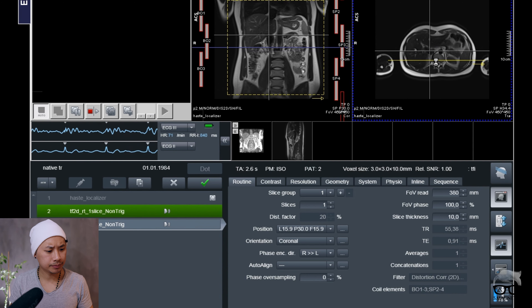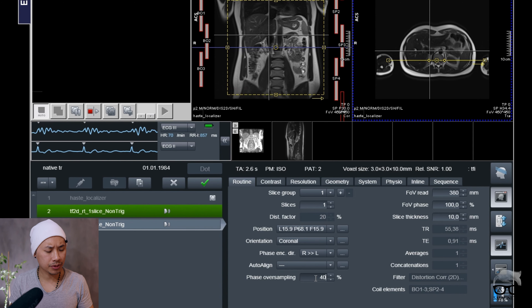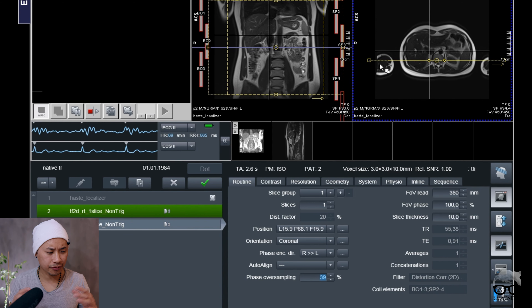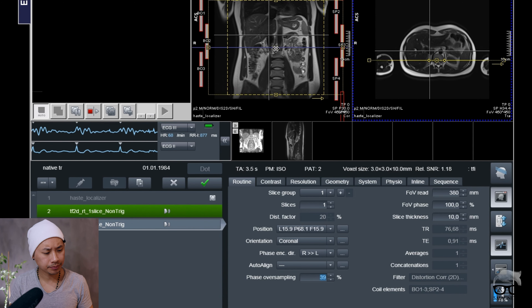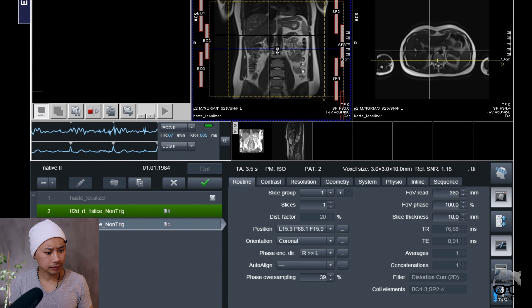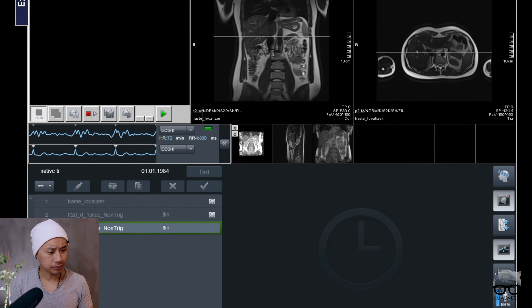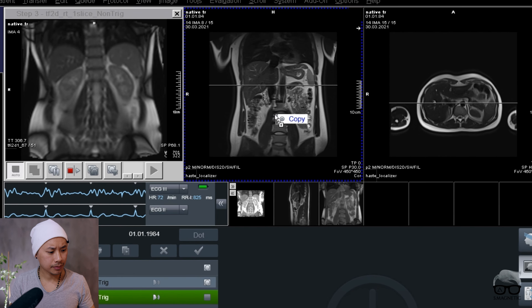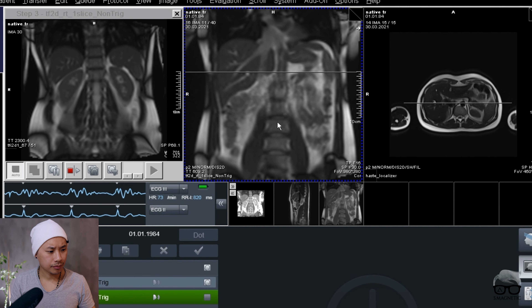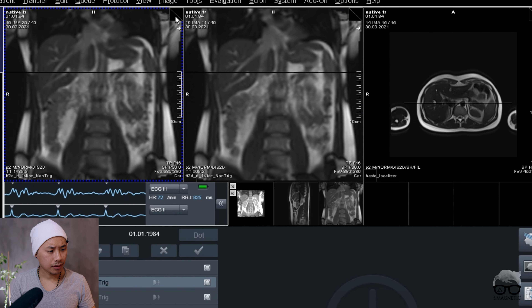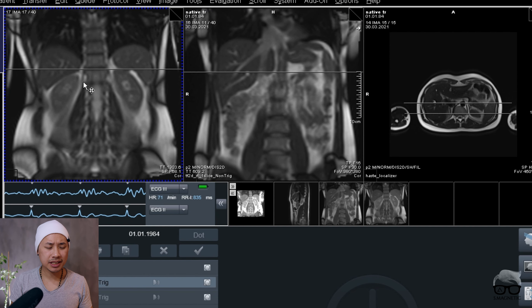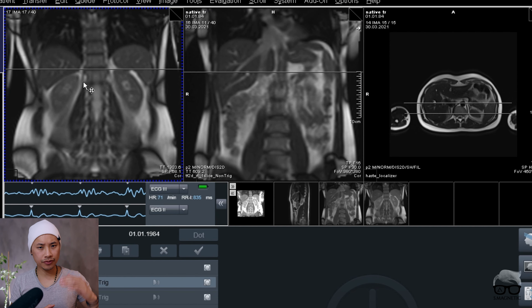Scan that one for the liver part, and we're going to do another scan here for the kidneys. I'll add a little bit — about 40% — to account for fold-over, and let's check the results.